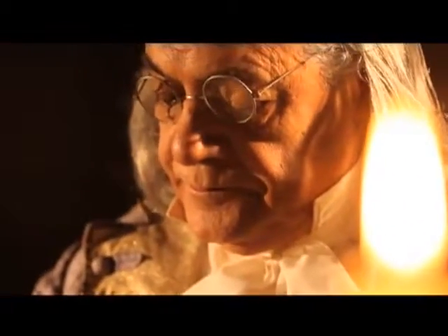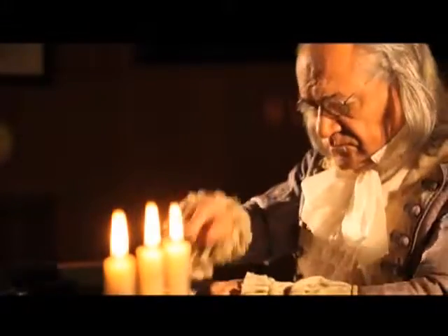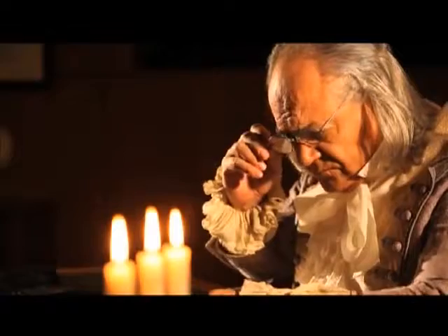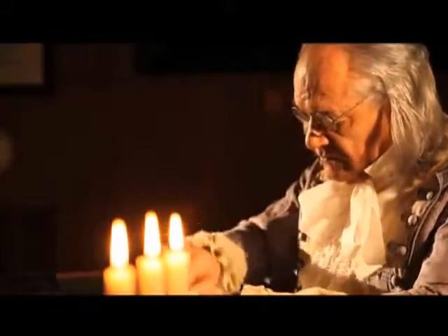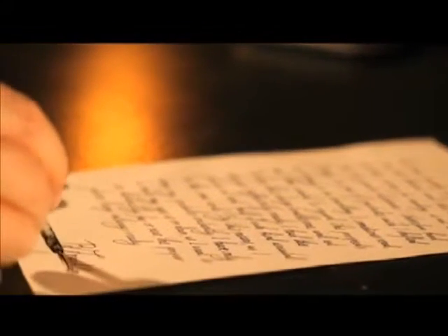Benjamin Franklin was the first human being to conceive that two glasses could be combined into one and to use them for the purpose of both distance and near vision. Given that he was writing documents and reading the whole day long, he developed this idea for practical reasons, and he should be acknowledged as the first person to conceive the multifocal concept for glasses.